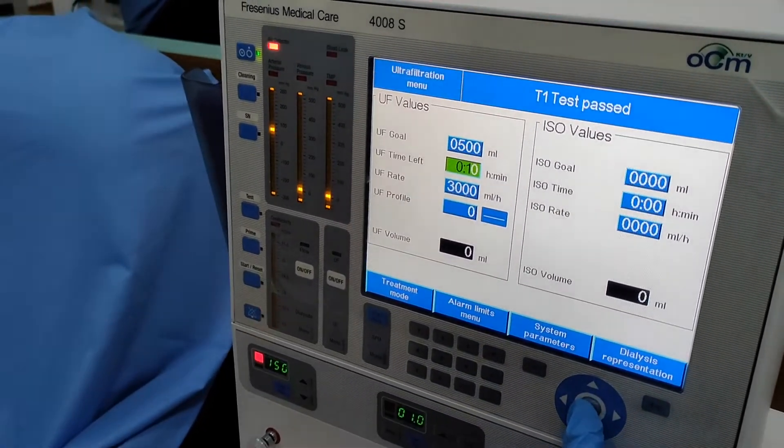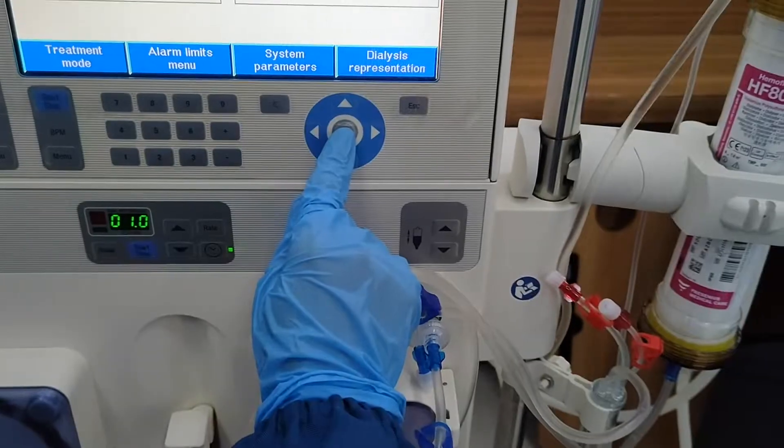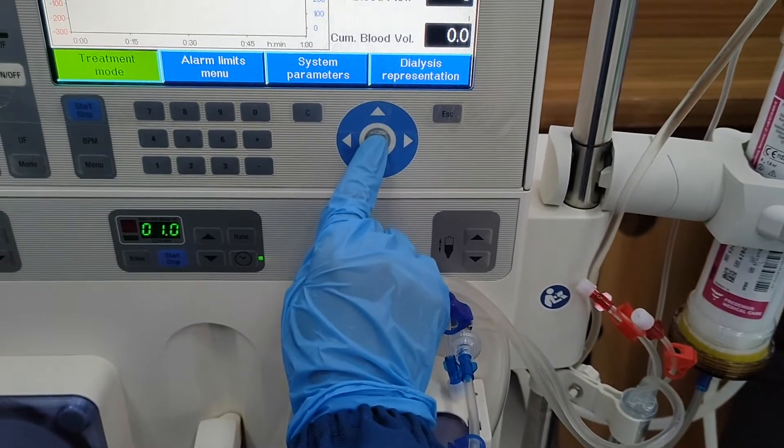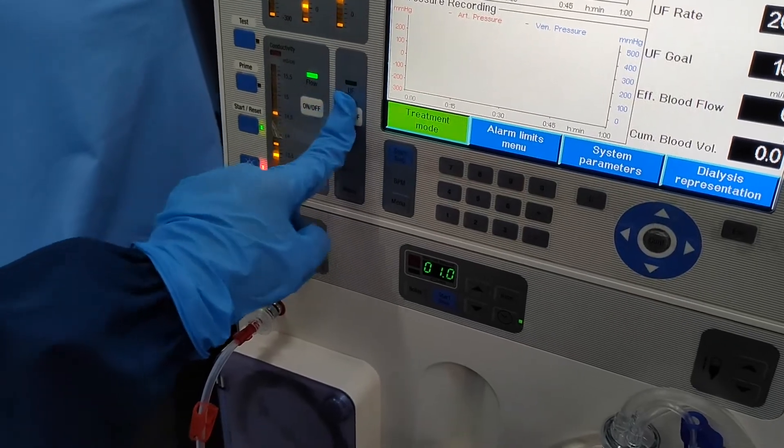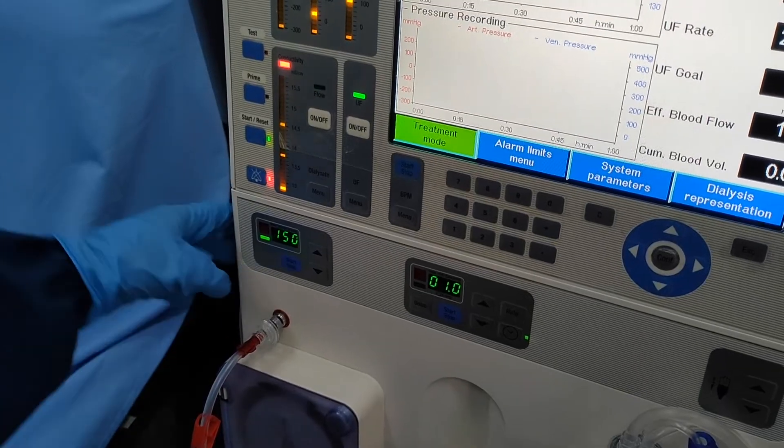Unclamp both lines, press confirm, turn on the UF and flow, press start button, and increase the BFR to 250.